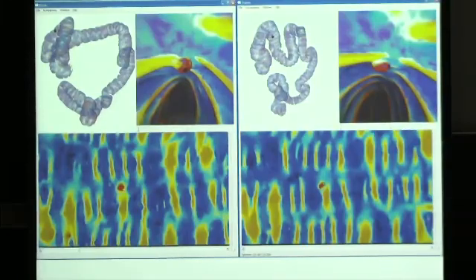And we transformed that automatically using our registration into the supine image. And this transformed point also overlaps with the polyp. So this is a great result because really what we want to do is develop a tool that radiologists can use for visualization so that if they see something of interest, say in the prone image, they can just click on it and instantly have the corresponding view in the supine.